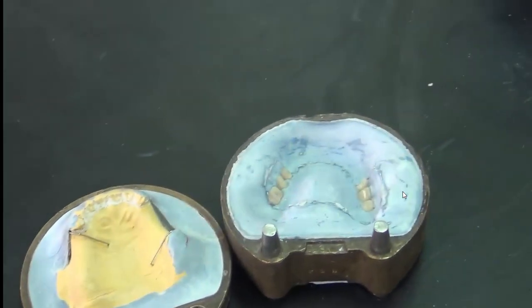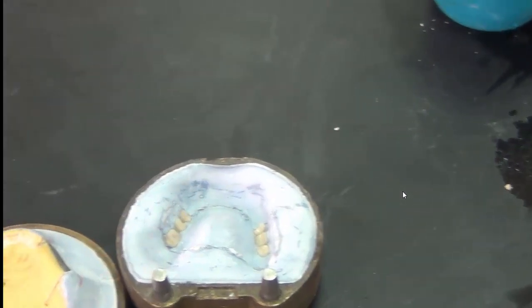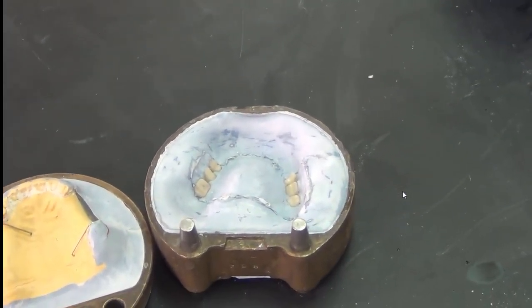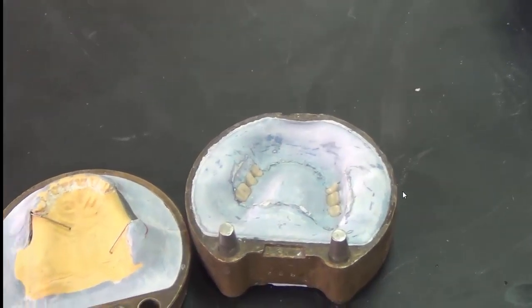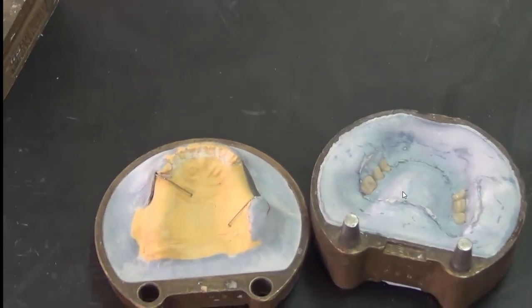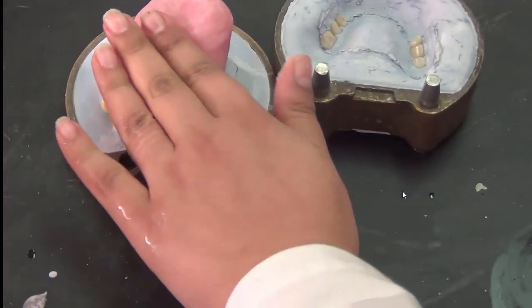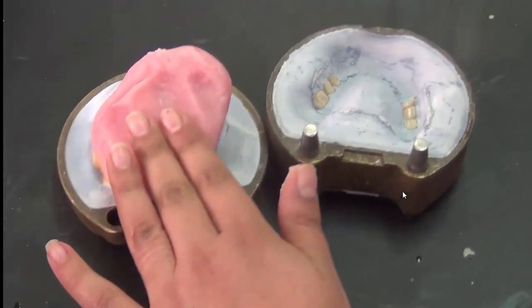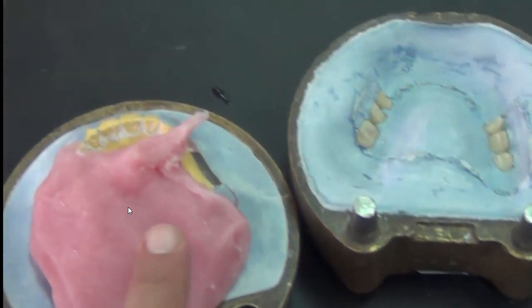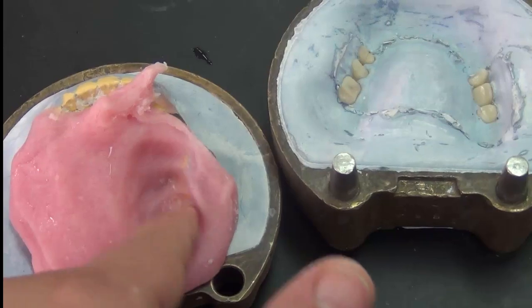So we gather our material with our wet hands or Vaseline soaked hands because we need to make sure that the material is not adherent to our fingers. And it's better even to be gloved fingers. We put it inside. We try to pack it in two halves. Half of the material we place on the lower half. In this half of the material, we try to make sure we're going under the wire.